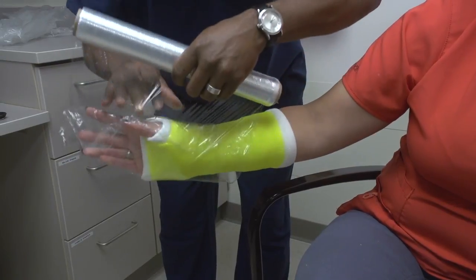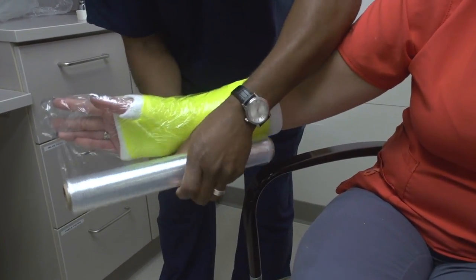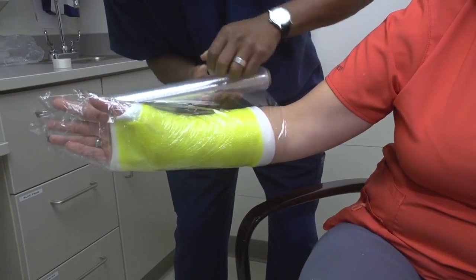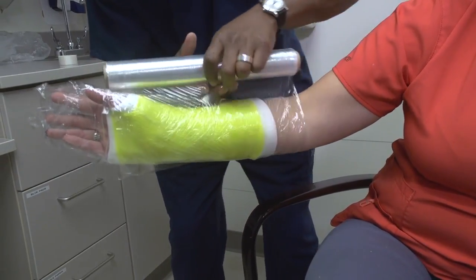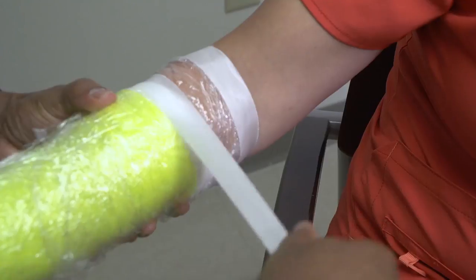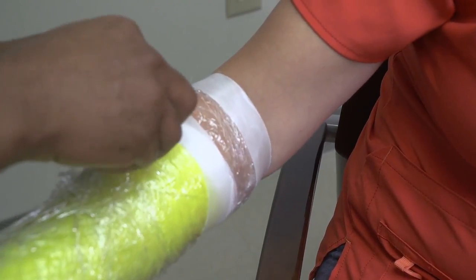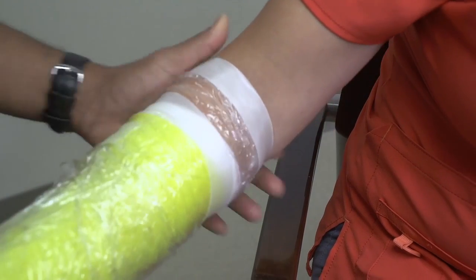When showering or bathing, it's recommended to wrap and cover the cast with plastic wrap from bottom to top, making sure the plastic wrap goes above the top of the cast. Secure the plastic wrap at the top with medical tape. The tape is to prevent water from sliding down into the cast.